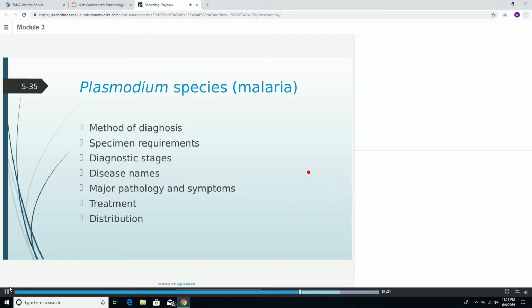We're going to want to do both thick and thin smears for malaria. Negative morning and afternoon thick stain smears for 3 consecutive days during symptoms indicate an absence of infection. We could also do a rapid immunochromatographic dipstick antigen detection test for malaria. Only one of these tests is used in the United States.